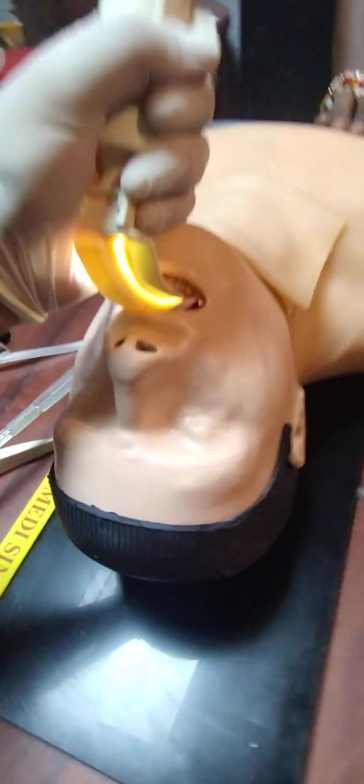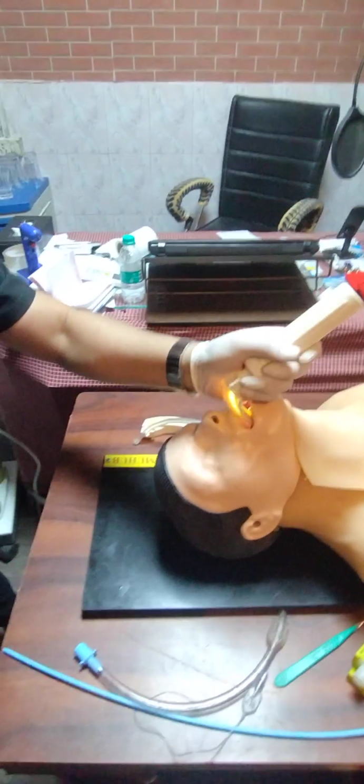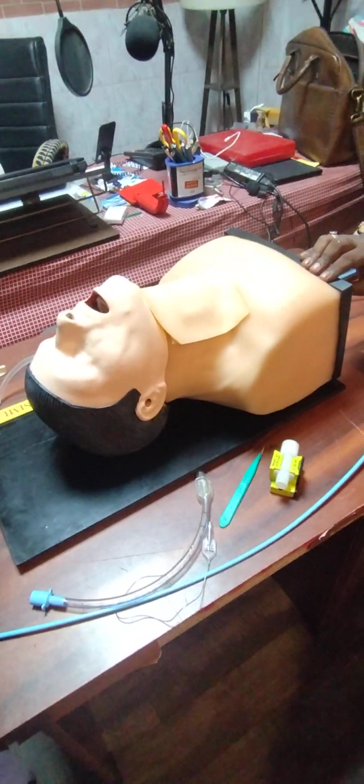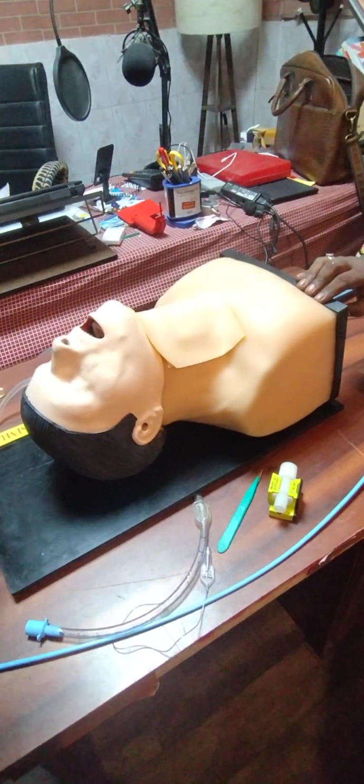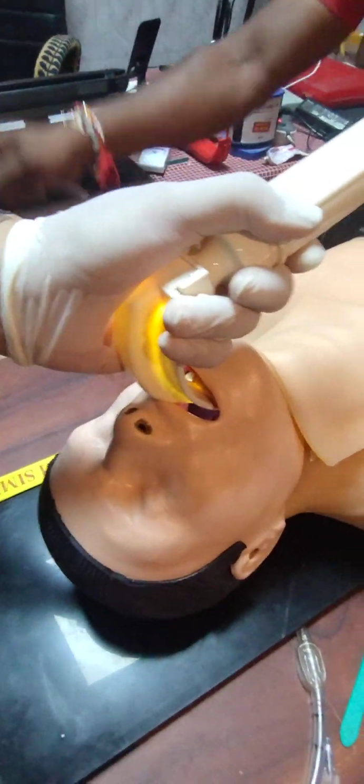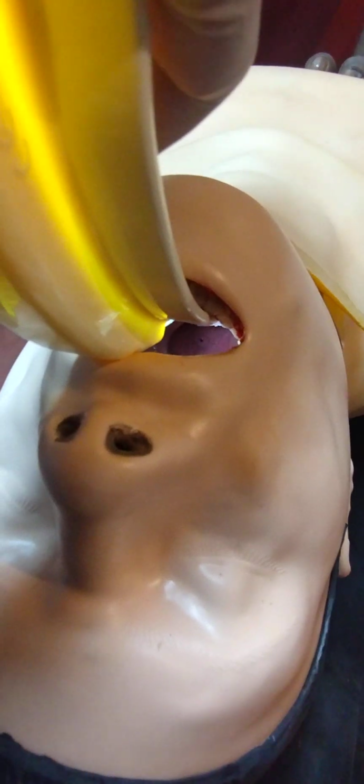So I cannot see. Now you go inside. So yes, I can just see the epiglottis. Okay, but I am not able to see the glottic opening. So maybe now I want to introduce a four blade. Able to see only the epiglottis. With this, I can see only the epiglottis, but there is no glottic opening.